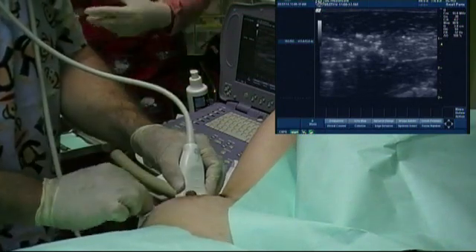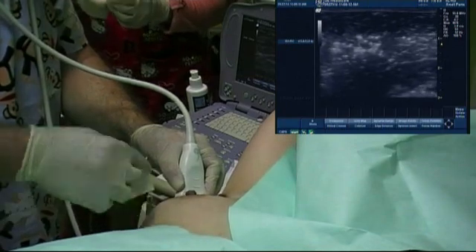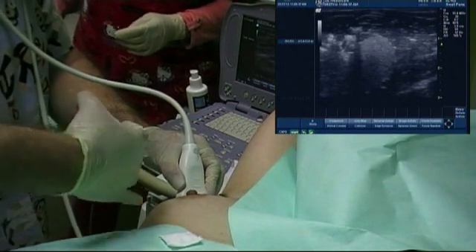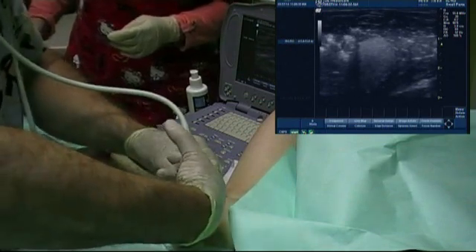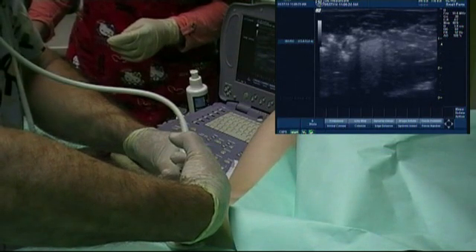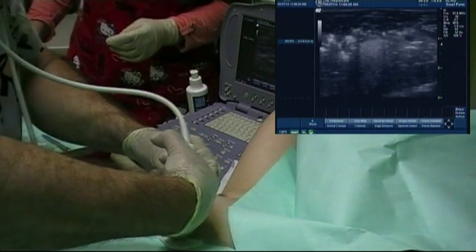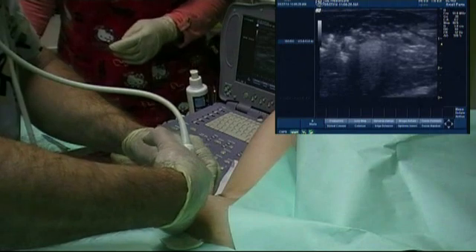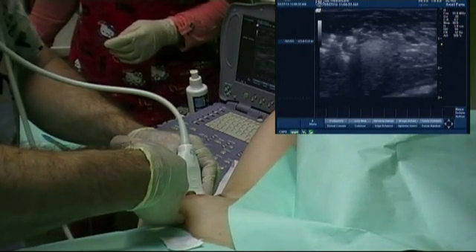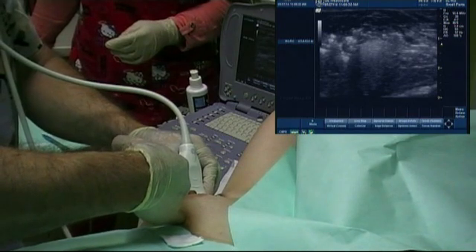With our non-dominant hand, we hold the transducer firmly over the lesion with enough pressure to immobilize it, but not too much as it will obscure the shadow of the needle. With the dominant hand, we can infiltrate the skin and underlying tissue with lidocaine 2%, with or without adrenaline, following the estimated needle track.